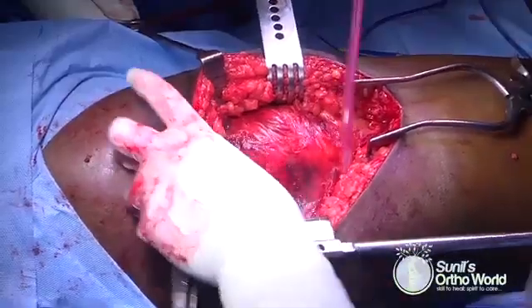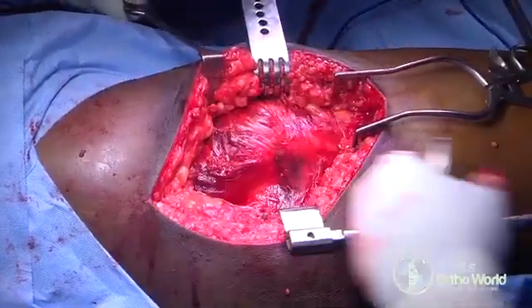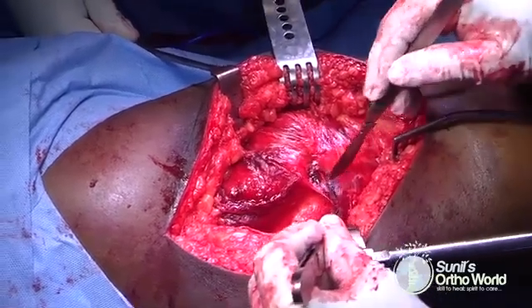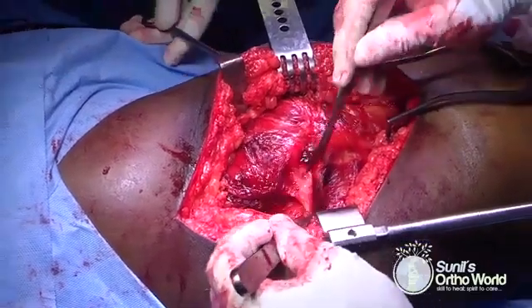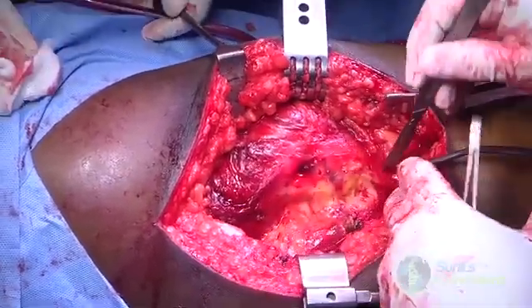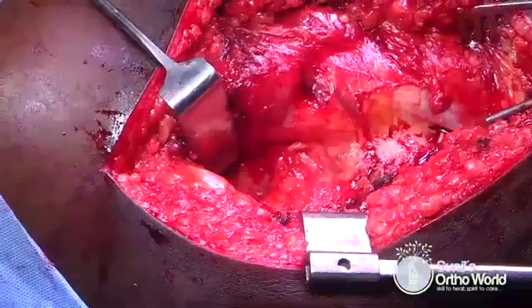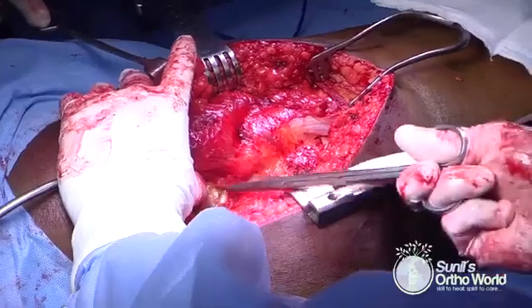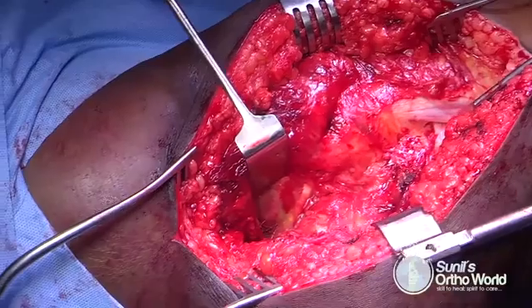Retrotrochanteric exposure can be improved by bringing the limb into extension. The trochanter bursa is then gently teased off to identify the posterior structures. The sciatic nerve lies over the quadratus femoris and should be identified and isolated when using surgical dislocation for an acetabular fracture, but it is not required when using it for a femoral head fracture dislocation. The posterior border of the gluteus medius muscle is identified and retracted to expose the piriformis tendon and the underlying gluteus minimus muscle.